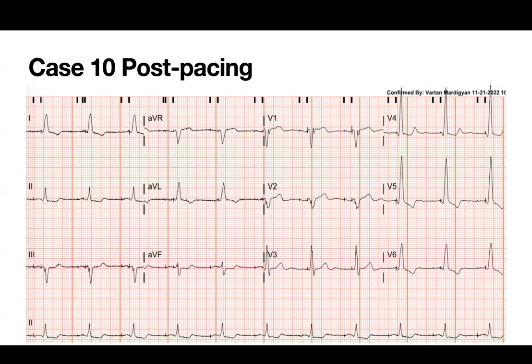I would have stopped. And also, there are other things. You see a tiny bit of a Q at the beginning before it starts, almost like a latency in V3. I don't think you can get farther. You're at the endocardial surface of the left side.